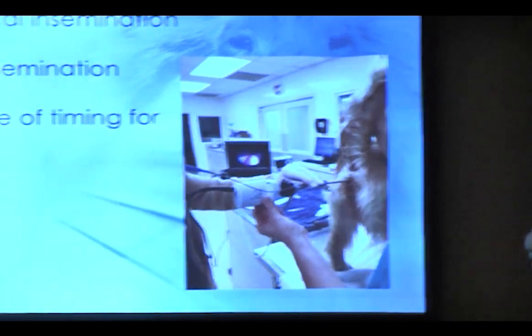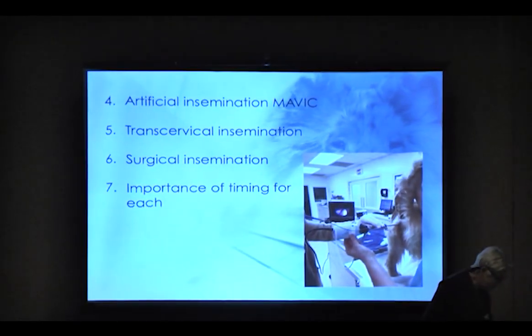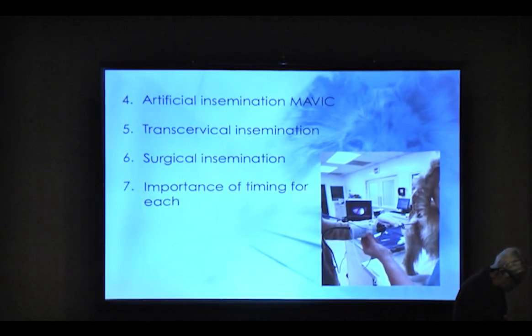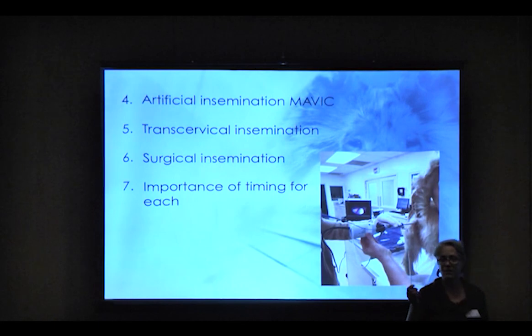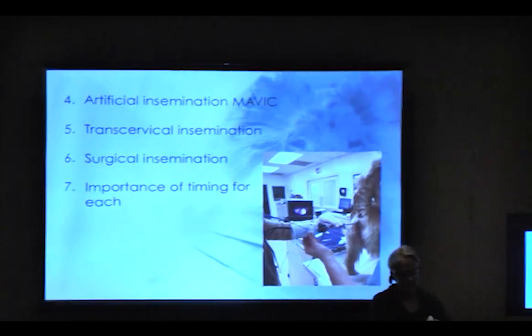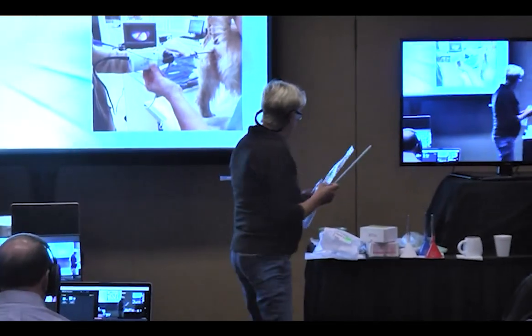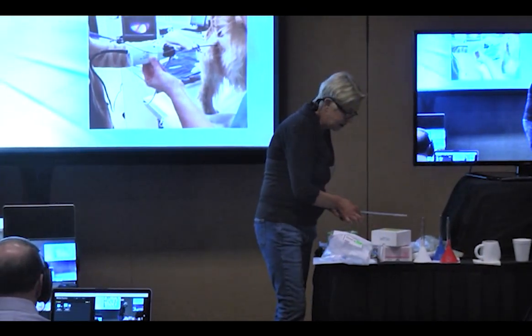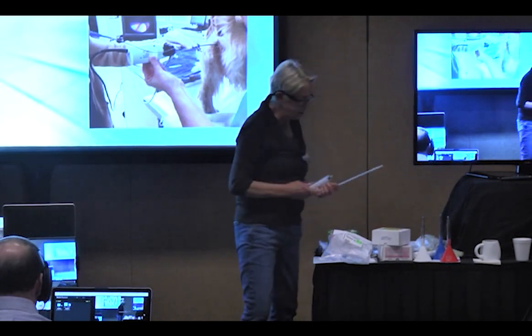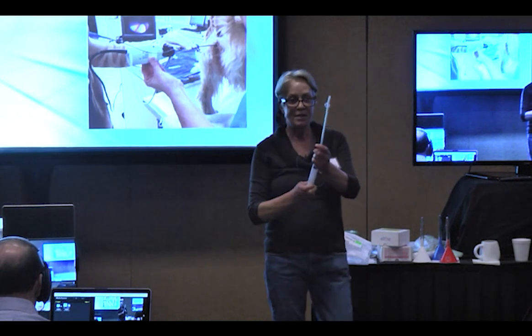Artificial insemination, we're going to do one of those today. MiniTube has come out with these great tubes. We all know about this one, right? This is a Mavic. The Mavic actually has a little port where you blow it up. Do you see it?